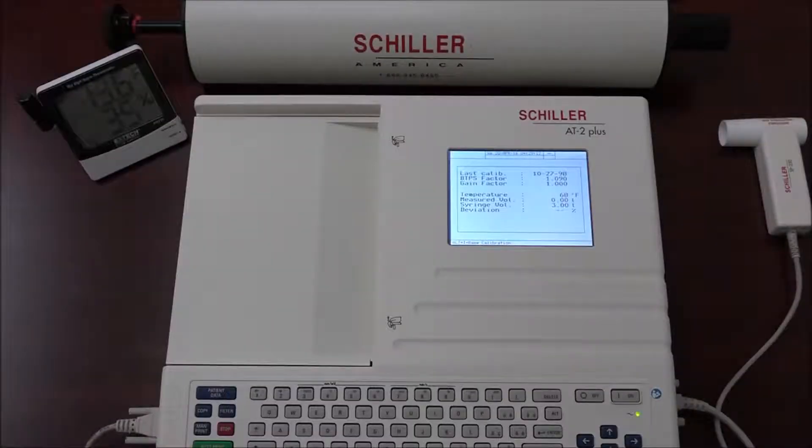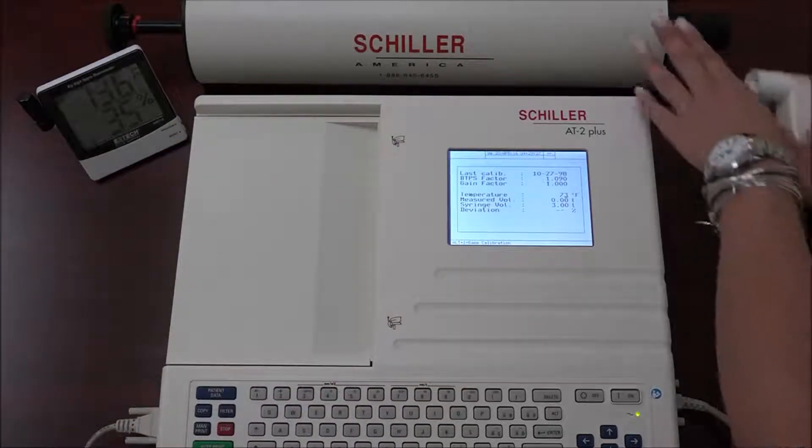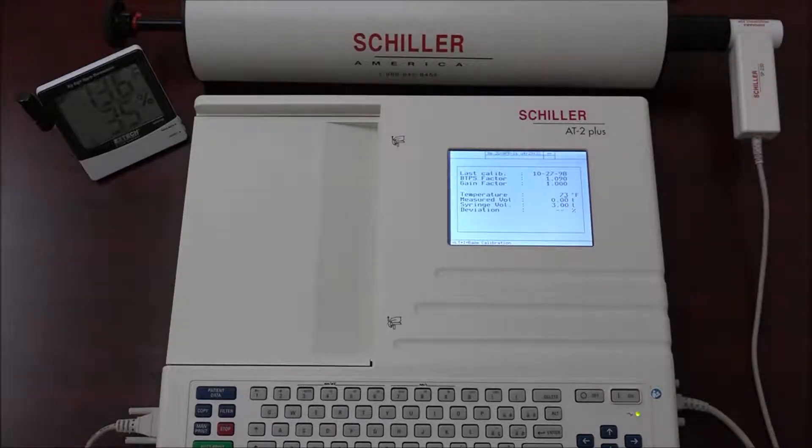To calibrate the unit, make sure you input the correct ambient temperature and press the auto start key. Pump between 4 to 9 liters of air through the sensor and make sure to adjust the reference volume based on how many liters were pumped. Make sure the sensor is kept still during the pumping operation.